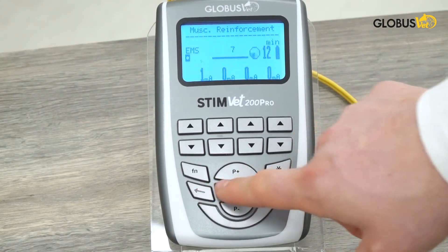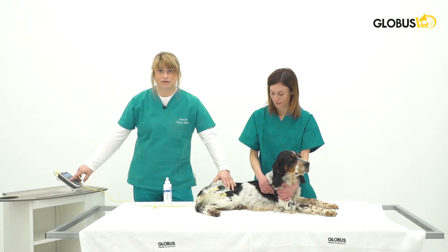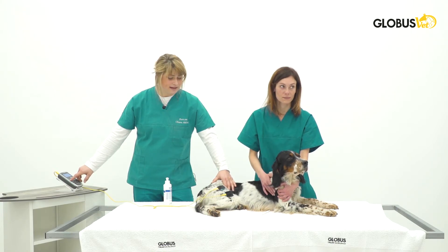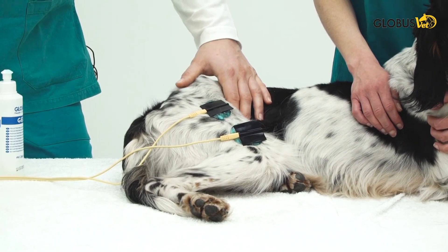When we reach our intensity level, we should either stay still or turn the intensity down a little bit lower. Then we will increase the intensity up again once we reach a steady situation.